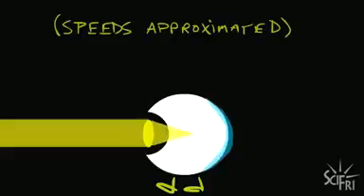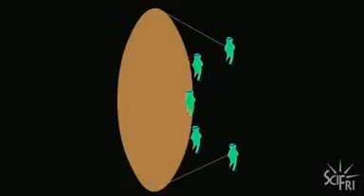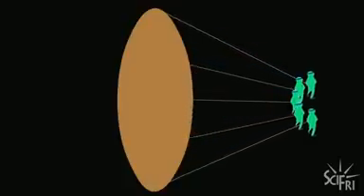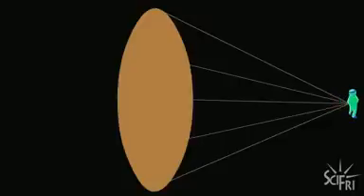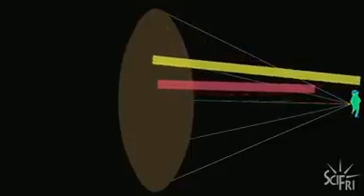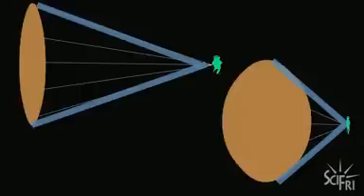It slows down. The difference in the eye is that you can only see an object when the light gets back in sync. But to get the photons back in sync, or the runners in lockstep, the runners who are ahead have to travel farther than the runners that are behind. In other words, the runners that went through less mud have to travel a longer distance than the runners that went through more mud to let them catch up. And this only happens where the runners converge. Now, LASIK works on the same principle. By changing the shape of the cornea, or the mud patch, you change the position of the convergence point.